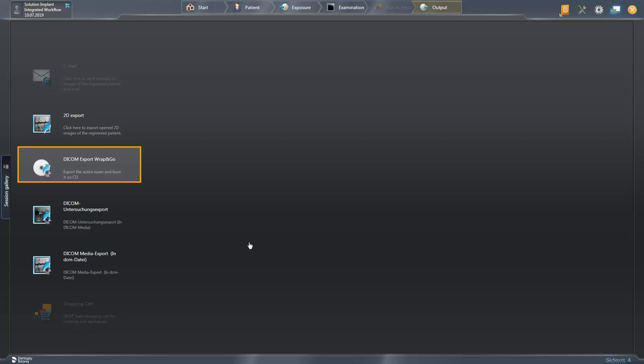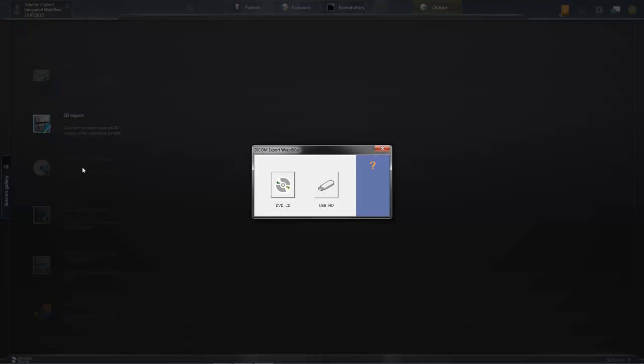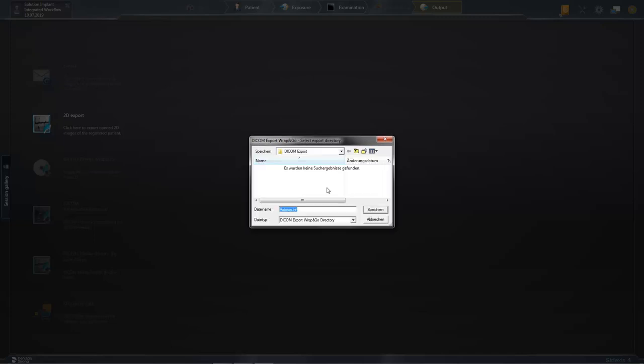After we have selected this export option, a new window opens. Here, you select the storage directory or storage medium. We choose the second option and after we have selected the appropriate storage directory, we confirm with SAVE.